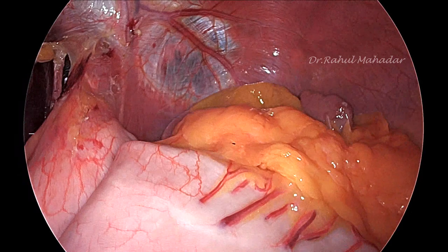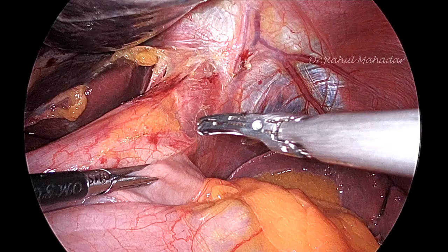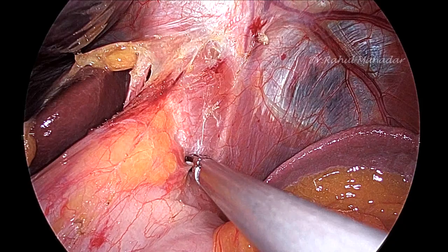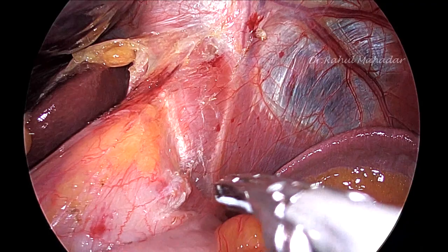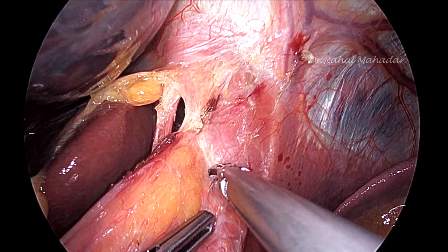Now ask the assistant to give traction towards the right side of the patient, and you can see the lateral attachments on the left side and the peritoneum over it. You have to just catch hold of the peritoneum and push the structures down, and you will see the peritoneal lining over the left crus as well. Always try to maintain the peritoneal lining over the crura on the left side.